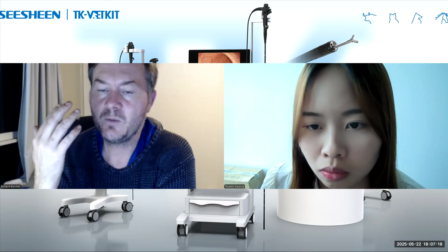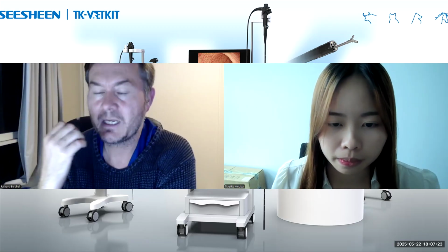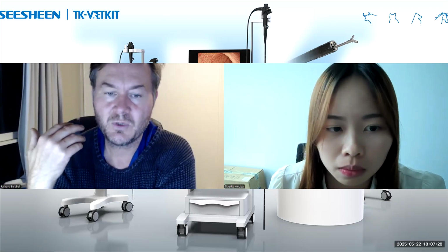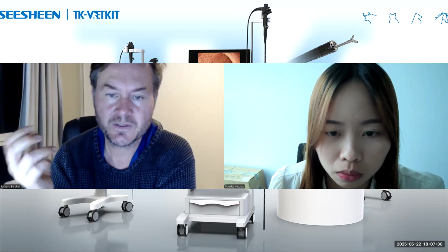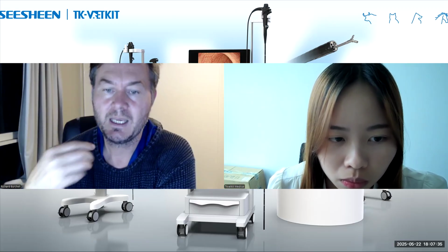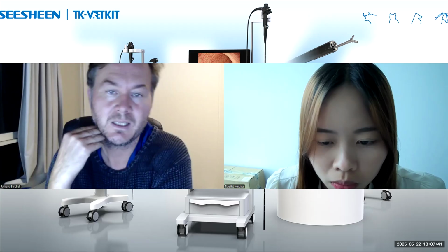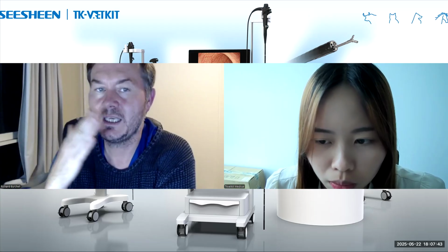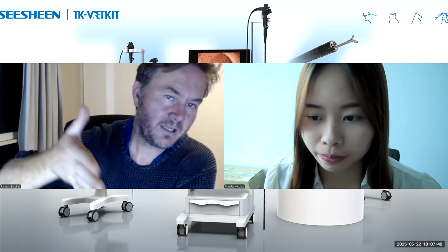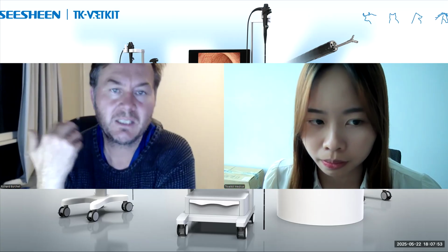And so we obviously use CT to evaluate their airway as well, but I like to evaluate their airway to identify aberrant turbinates, but also to identify sliding hiatal hernias. So I will put a scope into the esophagus, and then I'll occlude the ET tube and get them to breathe against some resistance to see whether there is a sliding hiatal hernia, because it gives you a good overview of the interplay between the respiratory system and the gastrointestinal system. So yeah, it's a very valuable tool.